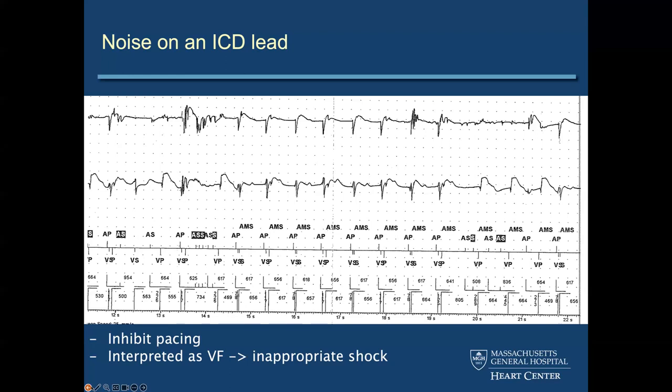You'll see it paces, and it happens that the atrial pace aligns with the ventricular event, which is being sensed on the atrial channel. The device is seeing this event and thinking, what I imagine the device is doing, I can't actually read its mind, it's an older device, but it seems to be interpreting this as possible crosstalk. And as a defense against the risk of having no backup pacing if the patient were to have no conduction, right? If it thinks it's crosstalk, it's going to have a backup or safety pace 50 milliseconds after the detected new sense. So this is a functional crosstalk detection.